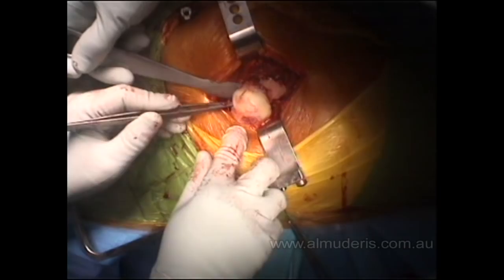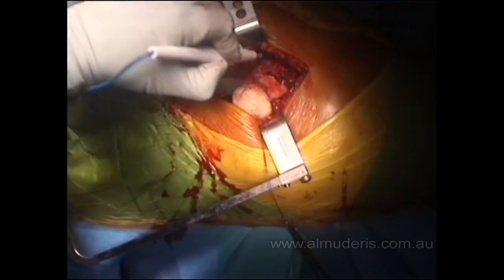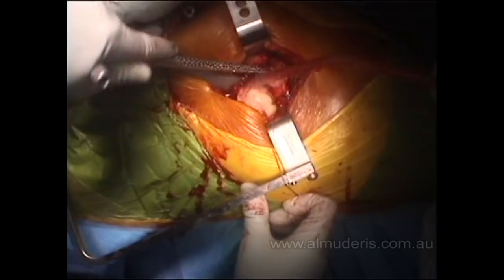You can see very clearly the avascular necrosis of the femoral head — that is the collapse of the femoral head and the head is completely deformed. This patient has avascular necrosis, or osteonecrosis, of the femoral head.